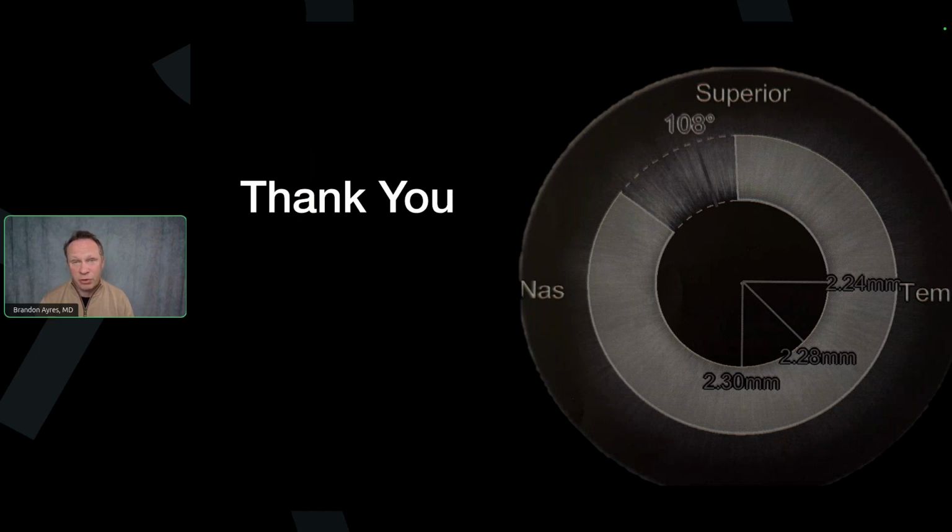So in order to answer this question, I had to talk to somebody who has. I reached out to Steve Greenstein, who has removed a segment. I think the patient just wasn't happy and wanted to try something different, so they took it out, and he said it was quite easy to remove. I am sure at some point, for some reason, we'll have to take a segment out, but we have had enough patients who are happy with it that we haven't had to do it yet. I don't have any direct experience myself, but when I do, I'll let you know. According to Greenstein, it was quite straightforward. It did not strongly incorporate fibrosis into the channel. He was able to open the channel and remove it quite simply.